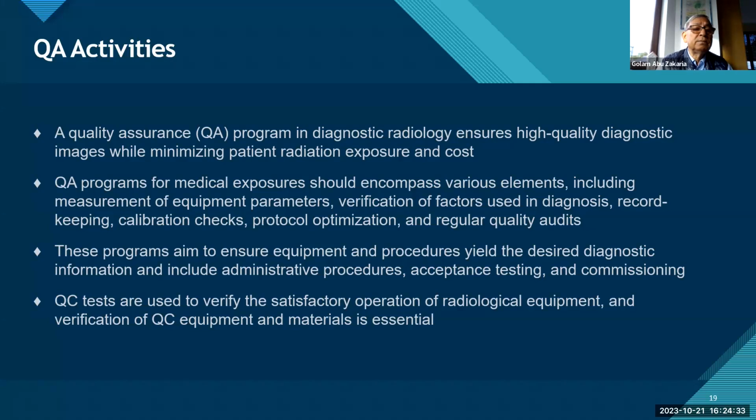QC tests are used to verify the satisfactory operation of radiological equipment, and verification of QC equipment and materials is essential. That means not only the CT machine needs a quality control program; even all the equipment you use for the quality control should also have a quality control program. Yes.